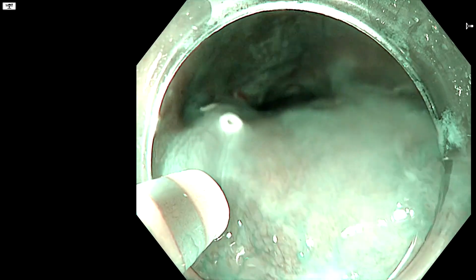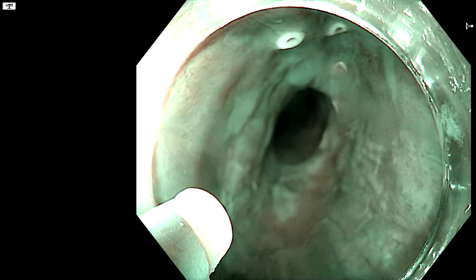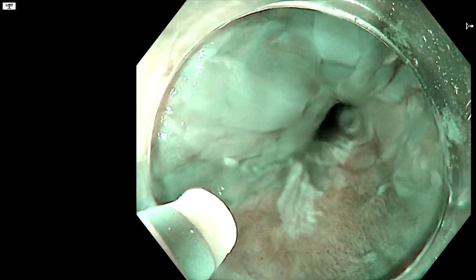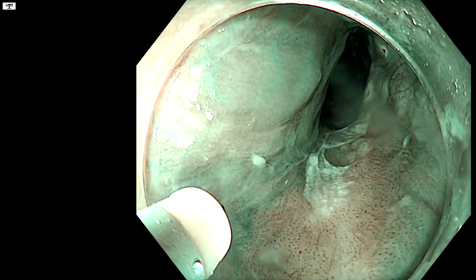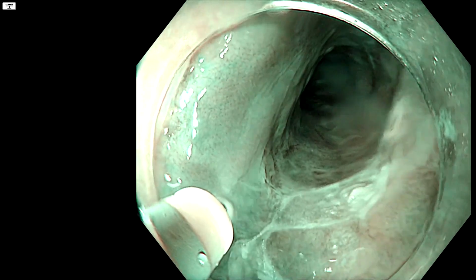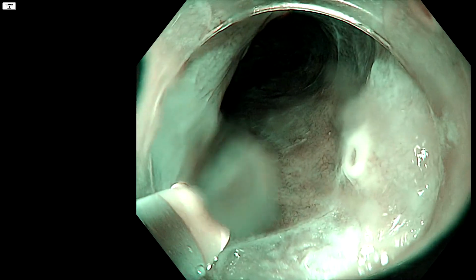I'm going to come up here. Going to check the other side first before we do that one again. So we're already right up in the sky here. And then let's check this side. So here's the bottom of the thing. I think probably if we come off a bit, this scope has dual focus. It's actually a lot easier to just use that rather than near focus. Probably we're down onto the bottom of it here.